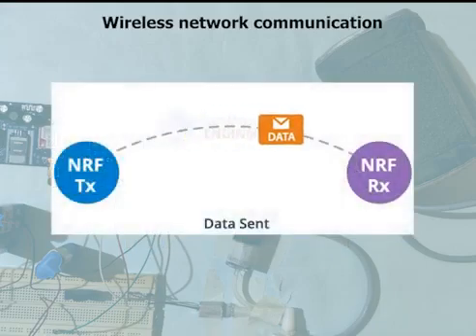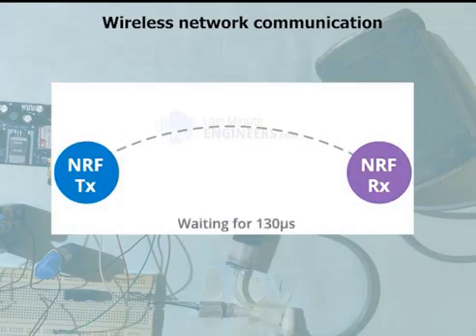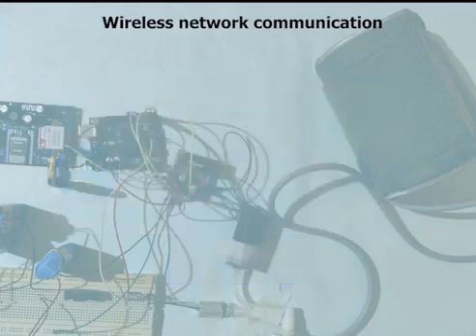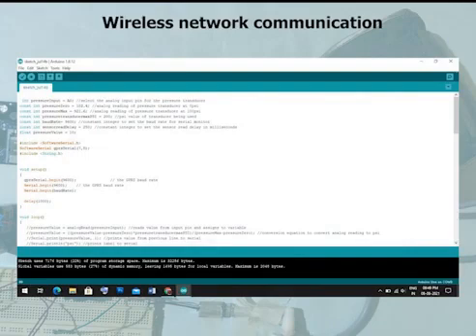The next step is wireless network communication. To enable this, we use a GSM SIM900A module interfaced to the Arduino Uno, and using IoT, we will send the obtained pressure sensor data onto a cloud platform called ThingSpeak. So in the code, we can see that the first step is to establish a serial monitoring connection on the Arduino to ensure that the microcontroller and the GSM module is on the same baud rate. That is, in our case, the baud rate should be 9600.